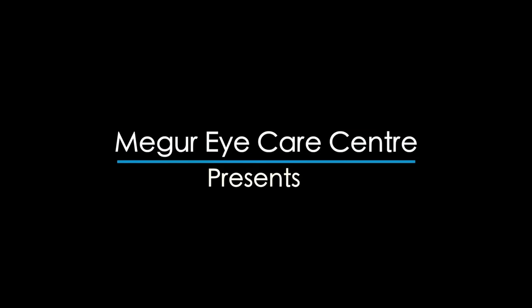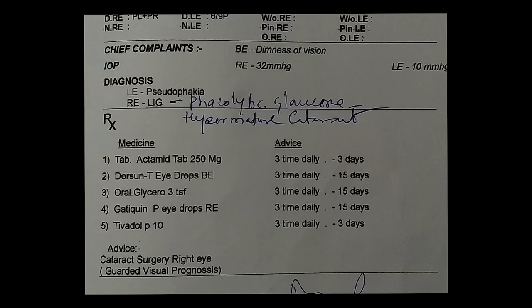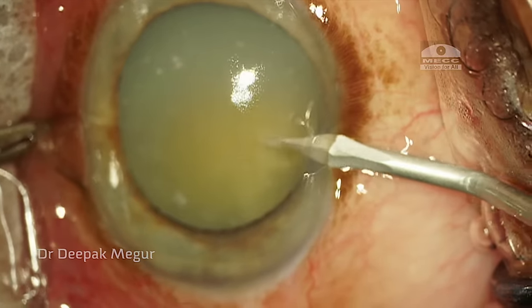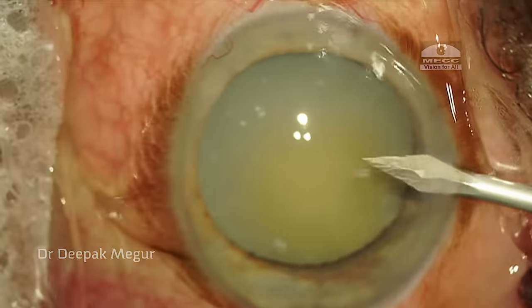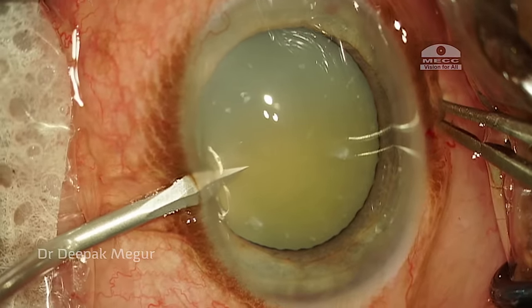Dear friends, this is a case about an elderly patient who has phacolytic glaucoma with hypermature cataract and loose zonules. The raised intraocular pressure was controlled preoperatively with IV mannitol and anti-glaucoma medications. This video is minimally edited and hence a bit long, but it has got many critical points for us to learn, so bear with me.